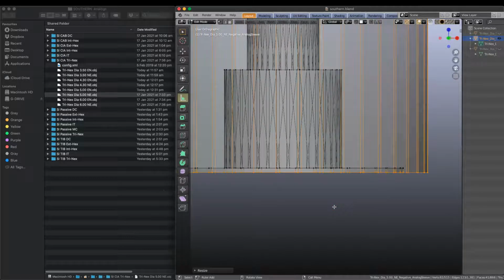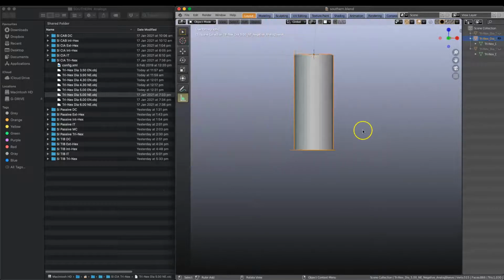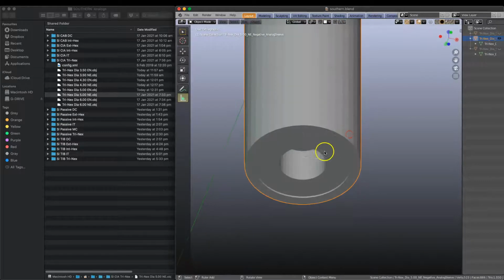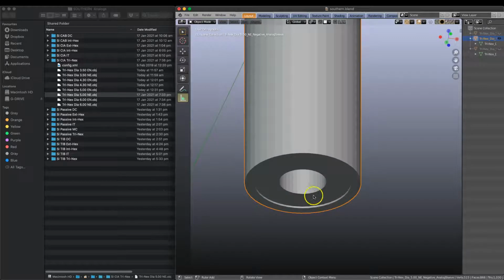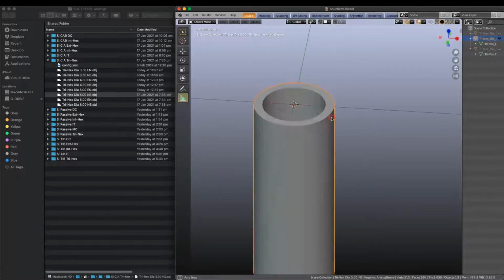Okay, so from here we can just tab out of edit mode, we can get out of transparent mode, and we can have a look at our component now. So we have the screw access hole from underneath. We haven't tampered with the plateau. Please don't tamper with any parts of the mesh geometry of the hole. So all we've done is created a wall thickness to it by selecting the outer edge loops of each one, the top and the bottom. And this is what it looks like from the top.